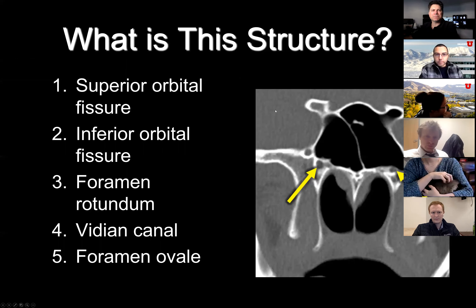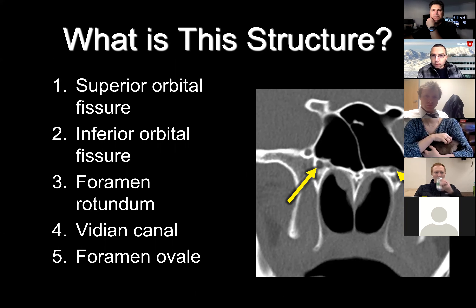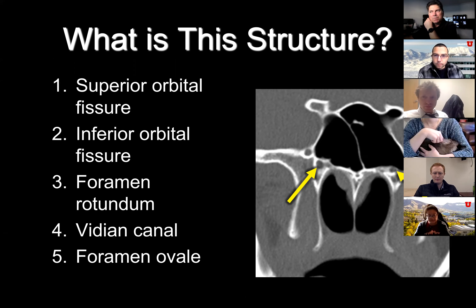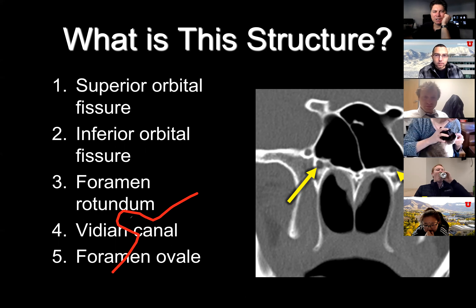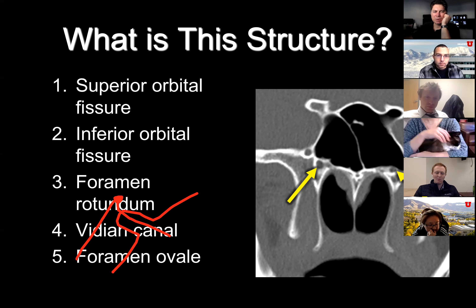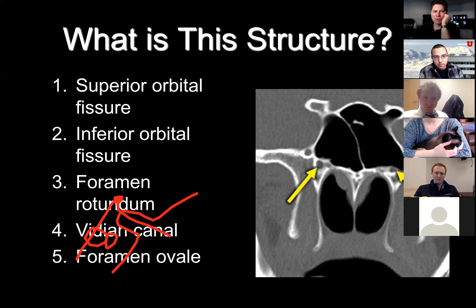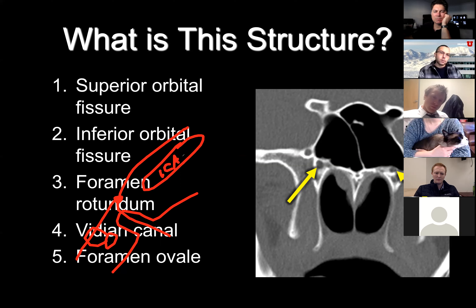That's the vidian canal — the vidian or pterygoid canal. What goes through there? The vidian nerve. What fibers make up the vidian nerve? The greater superficial petrosal nerve. When we think about where the ICA is and where CN7 comes in, there's the labyrinthine segment going forward to the geniculate ganglion, then the tympanic segment goes back under the lateral semicircular canal. The greater superficial petrosal nerve comes off there and goes immediately lateral to the ICA.